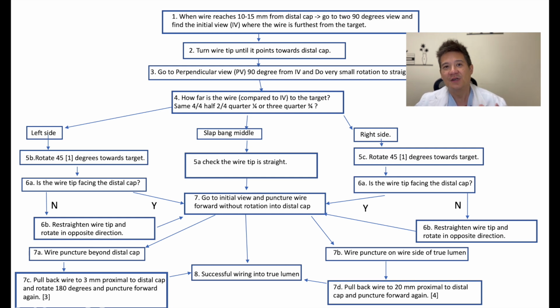So I hope you enjoy the algorithm, and the next two videos are going to tell us why we think this algorithm works and how it works.